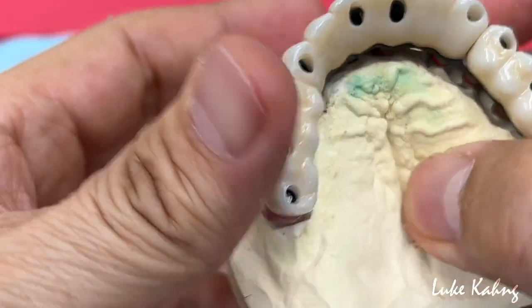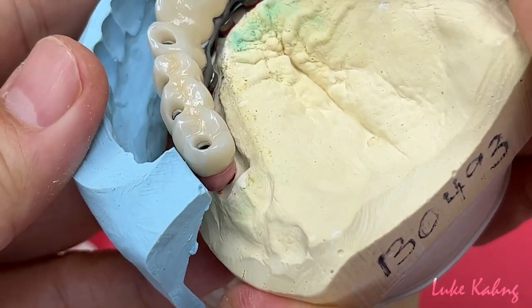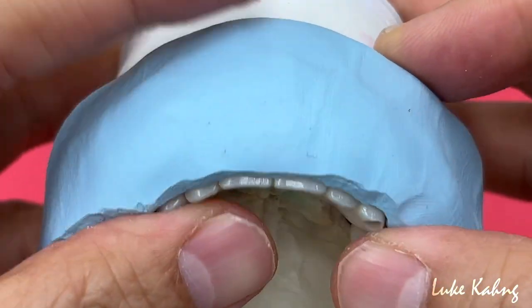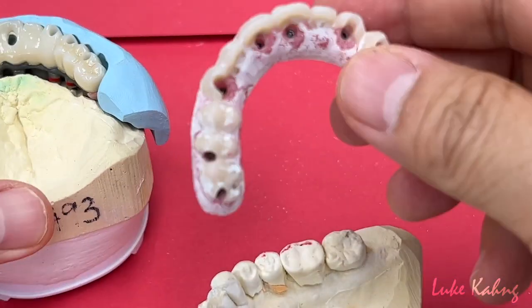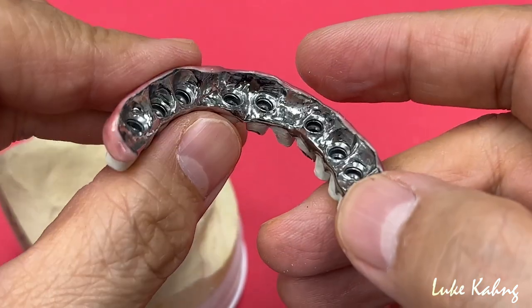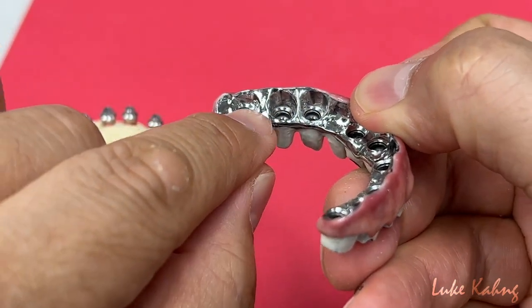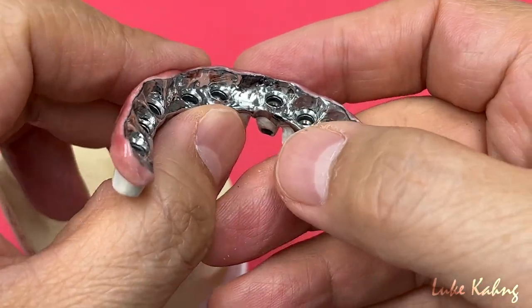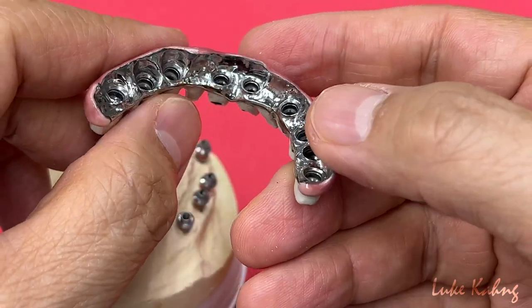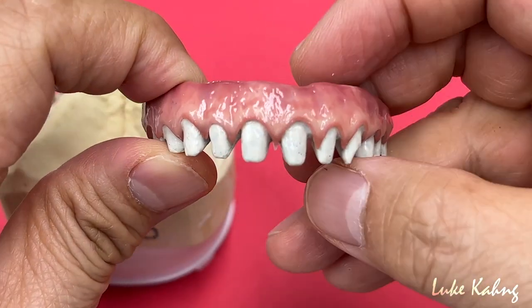These are the finals — we're going to cement soon and add the polish. We're going to follow the guidance, and the aesthetics are beautiful. The good thing is we found out how to do UCLA hand-crafting because there's no scan body available for CAD/CAM. We help these people by hand-crafting all their implants to the highest aesthetics possible.